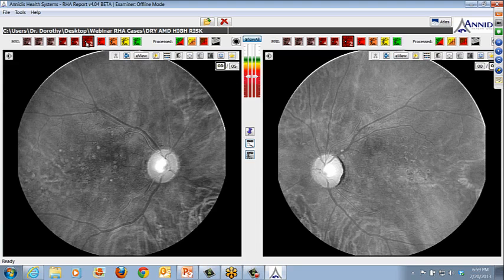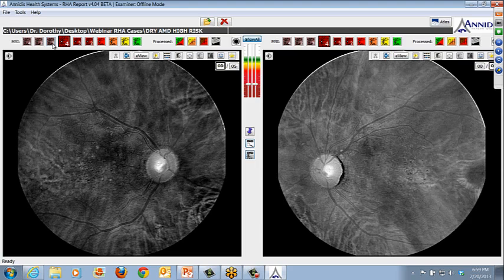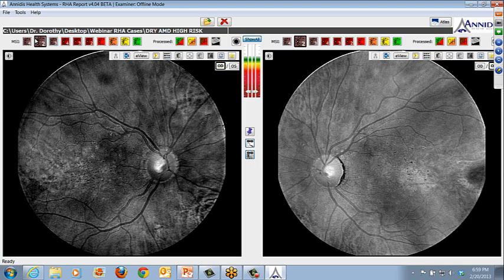As you move into the reds, again, the drusen appearance will start to fade as you get to 3-4 and you get deeper into the RPE, into the heaviest pigmented areas, and you'll lose some sight of the drusen and you'll start to pick up areas of RPE atrophy. And again, most hyper-reflective in 3 and 4, and will start to fade in the infrared.